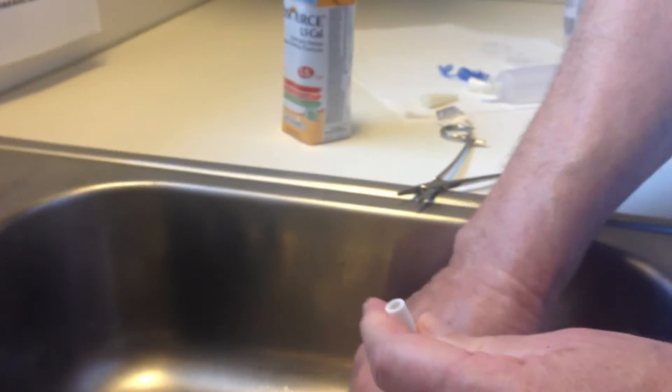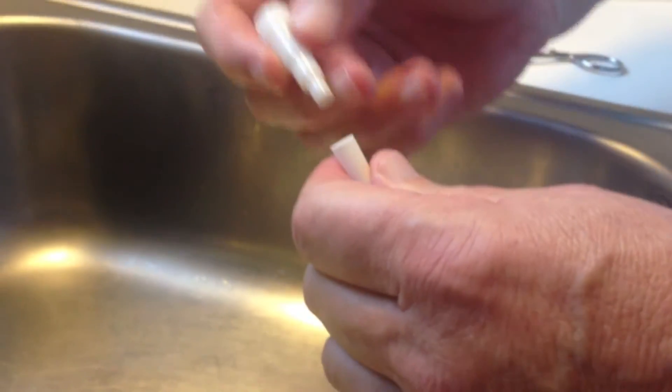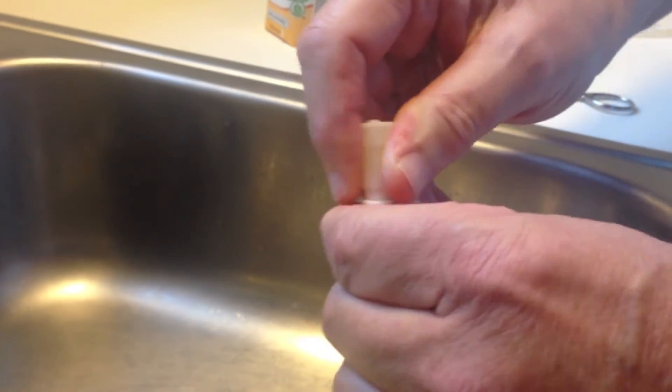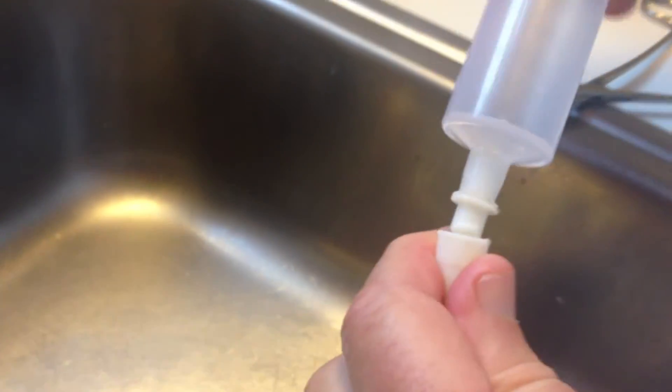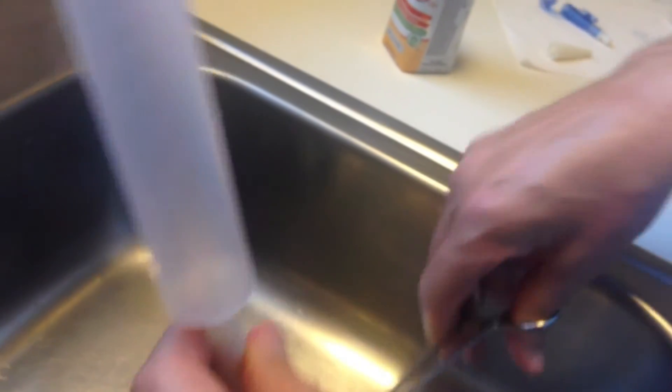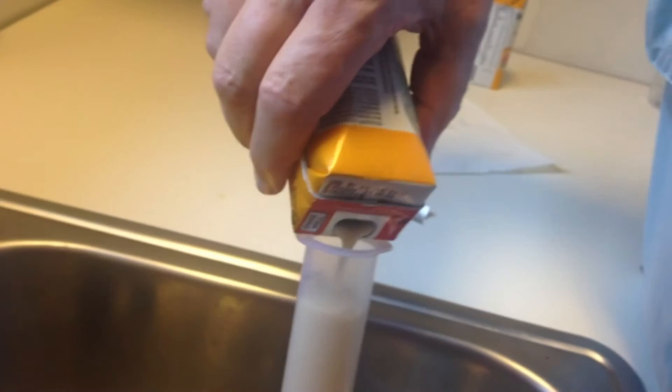Now let's replace this with the patient side 24 French ENFit connector. Then again, we will connect this to the ENFit syringe. Hemostat it off and fill it with 60 cc's of formula.